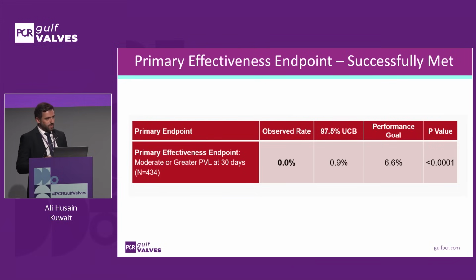Now, with regards to the primary effectiveness endpoint, that was successfully met as well. There was no moderate or greater paravalvular leak at 30 days.